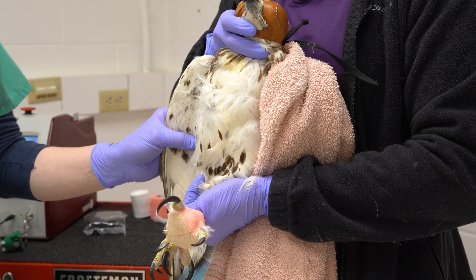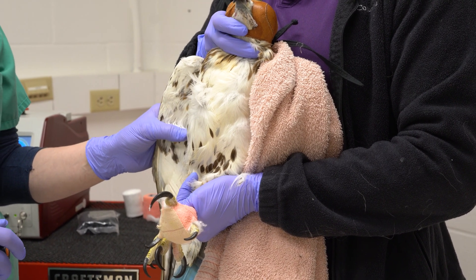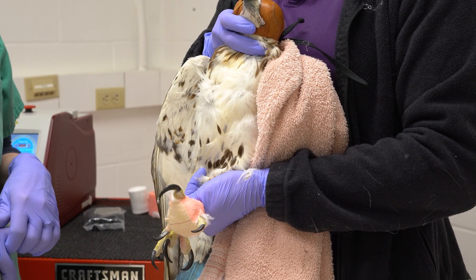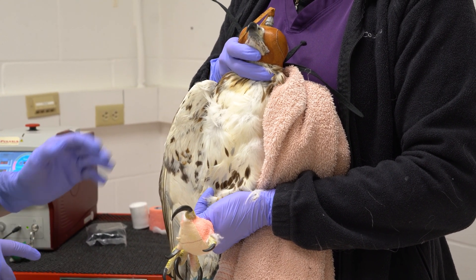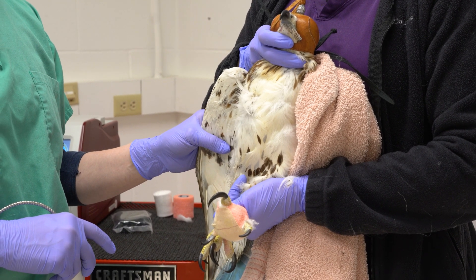Along with passive range of motion, cryotherapy, and bandaging, photobiomodulation can also assist in the healing process. For the purposes of this video, we will imagine that this area of the wing is devoid of feathers like the barred owl seen previously. Laser is a commonly used therapy in exotic or non-traditional animals, but the dose is varied.